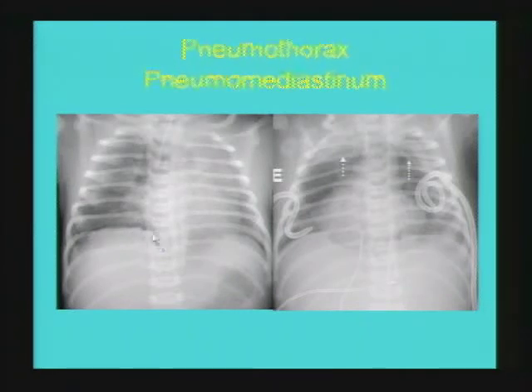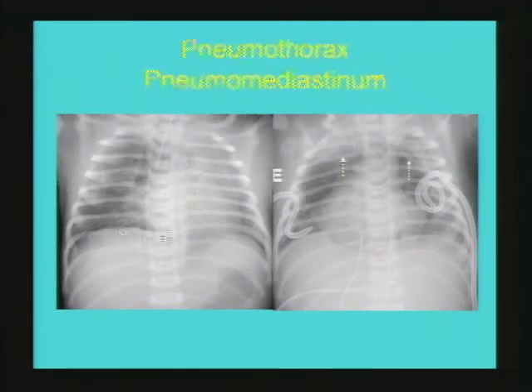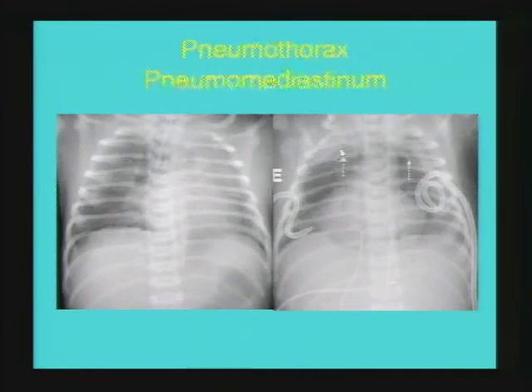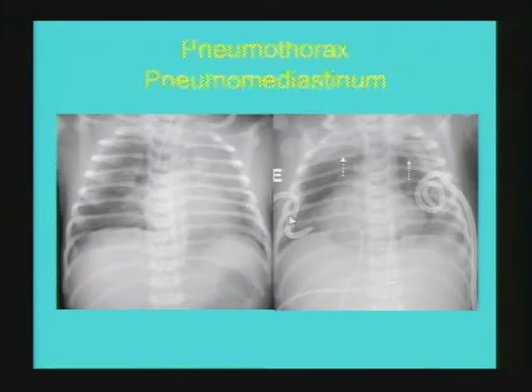This is an example of subtle pneumothorax on the right side, manifested as a deep right sulcus sign, sliver of air in the subpulmonic pleural space, and loculation of pneumothorax in the anterior mediastinum with generalized lucency of the right lung compared to the left. This is an example of pneumomediastinum manifesting as lucency overlying the mediastinum and displacement of the thymus above the cardiac silhouette. It is important to differentiate pneumomediastinum from pneumothorax, as pneumomediastinum resolves spontaneously and does not need drainage.